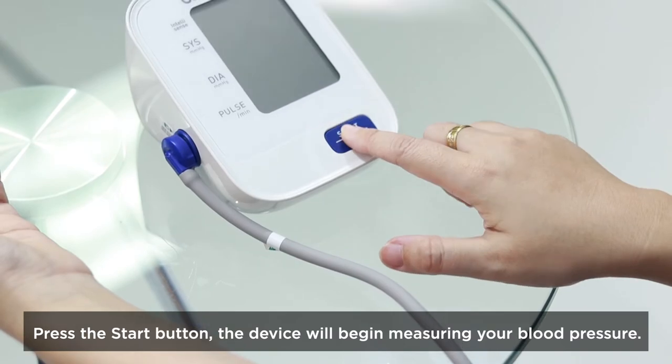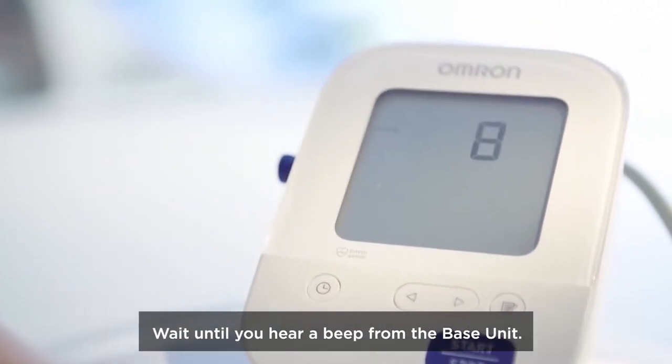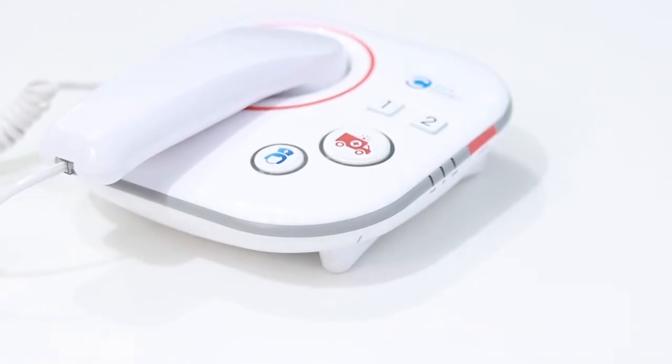Press the start button. The device will begin measuring your blood pressure. Wait until you hear a beep from the base unit indicating Bluetooth measure completed.